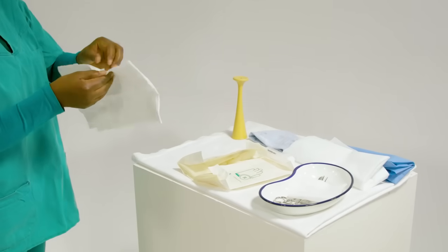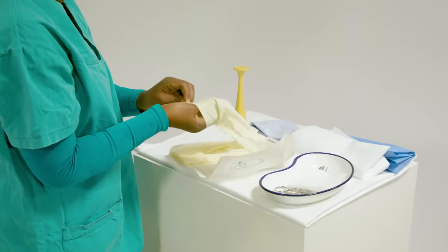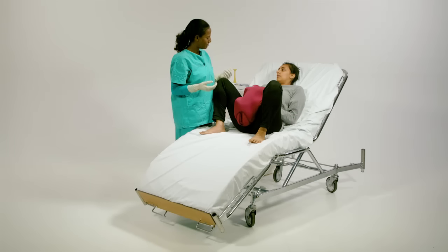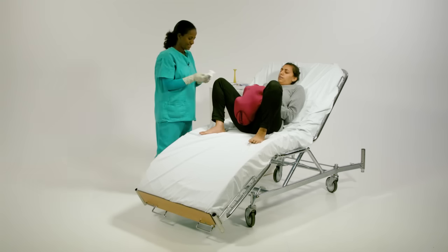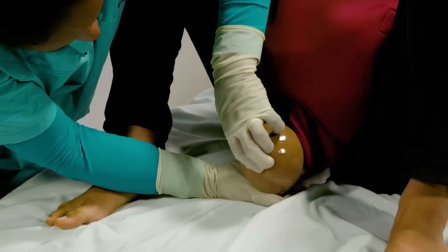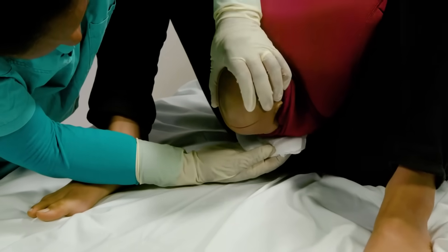The learner should now prepare for delivery. Wash hands and put on gloves. The learner communicates respectfully with the mother to explain what is happening and what they are about to do. Deliver the head and wait for external rotation of the head.